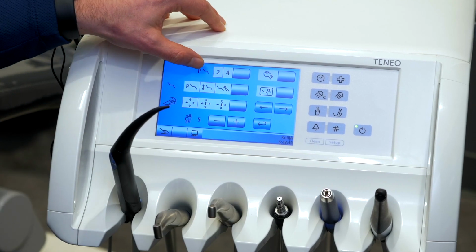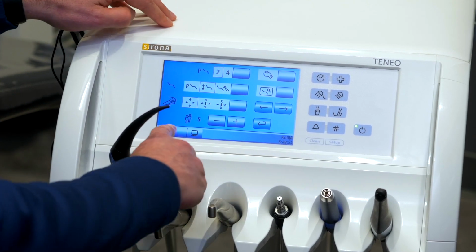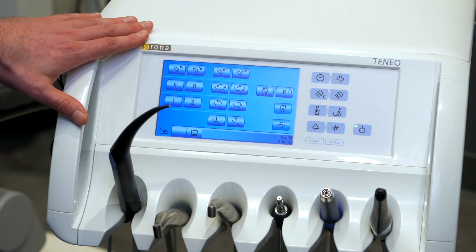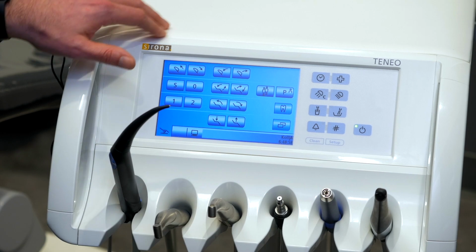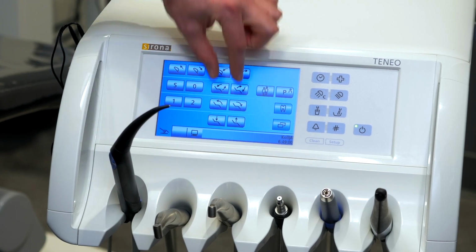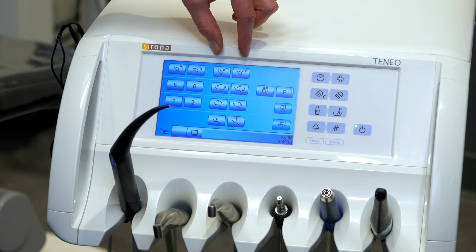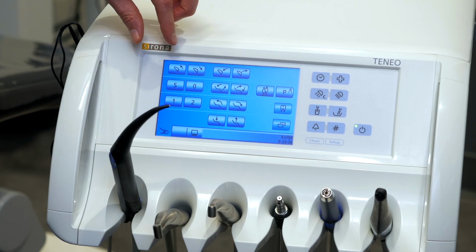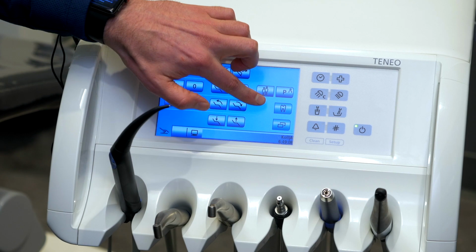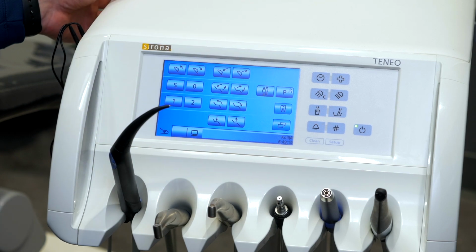If I go back into the setup menu and I change it to extended mode, now when I go back to my home screen, you can see we've extended the functionality available on the home screen. Now I have all the chair controls available in the middle slot of buttons. On the left, I have headrest S0, 1, and 2. And on the right, I have my other clinical functionalities available there.